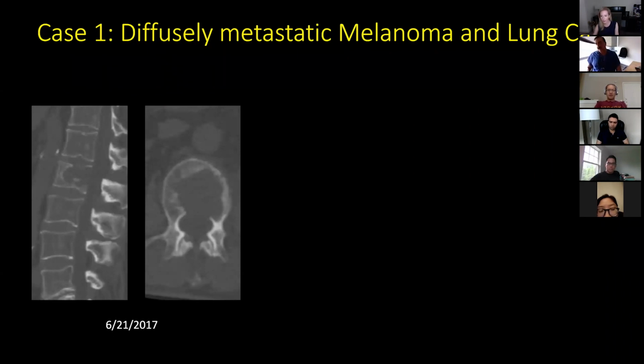But as I said, with these devices coming in, which have quite good protective mechanisms, especially the Kiva device and the curved balloons and all that, we are now venturing more and more into the vertebrae with destruction of almost all the walls.